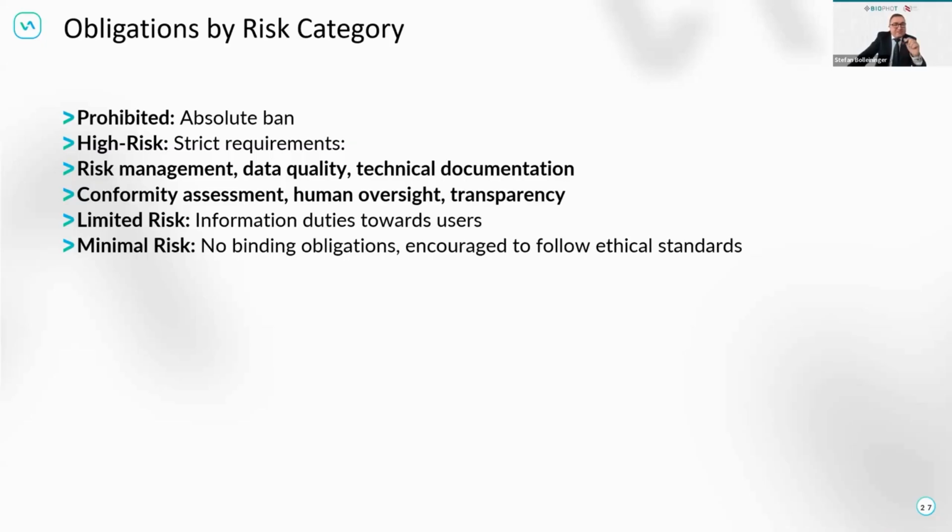Human oversight, conformity assessment, transparency. But always think about that the conformity assessment only can be done by one notified body in the current setup.